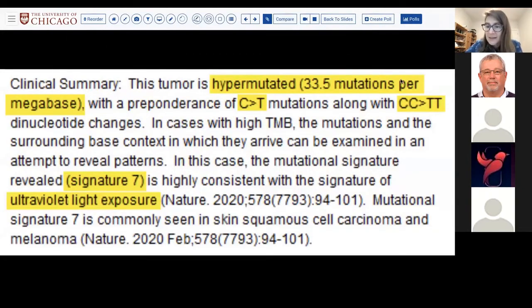In this case, the person who said metastasis is actually correct. So regardless of whether the person has had a cutaneous history or not, if a carcinoma looks squamous or squamoid, and you cannot prove that it's mucoepidermoid, you cannot prove that it's EBV or HPV, think about a sun exposed primary.